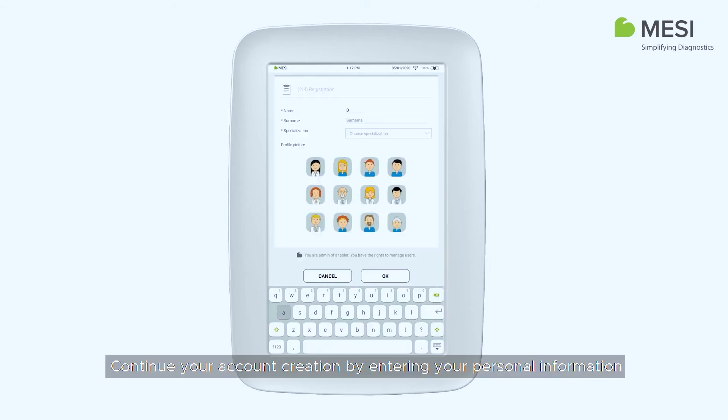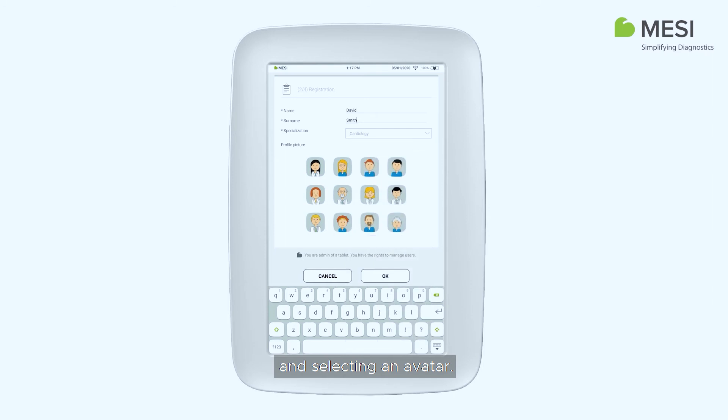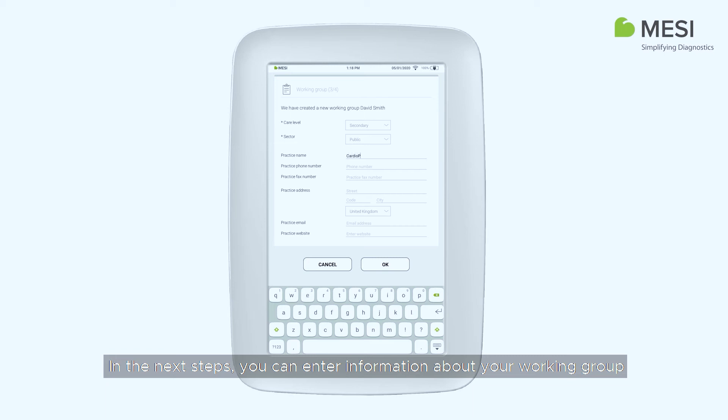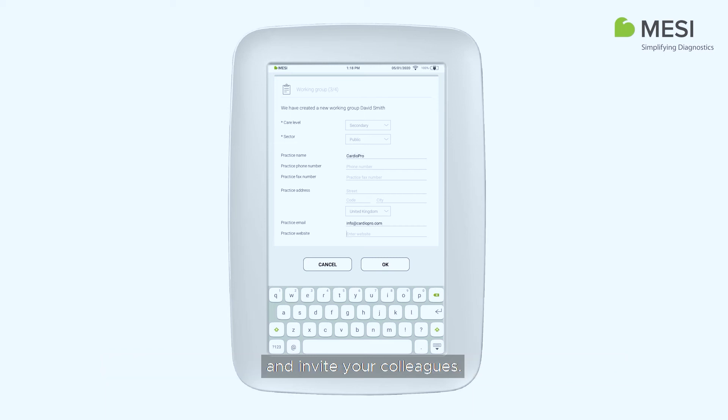Continue your account creation by entering your personal information and selecting an avatar. In the next steps, you can enter information about your working group and invite your colleagues.